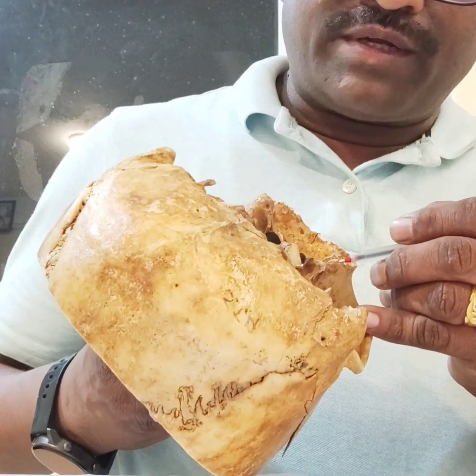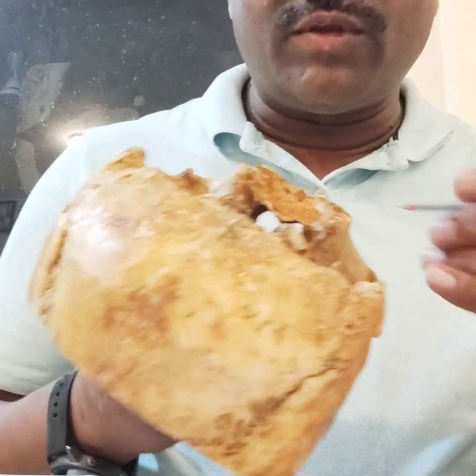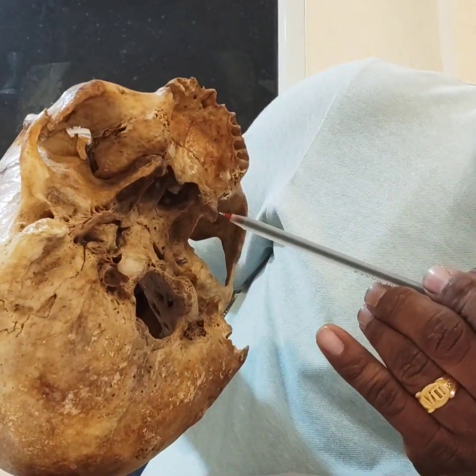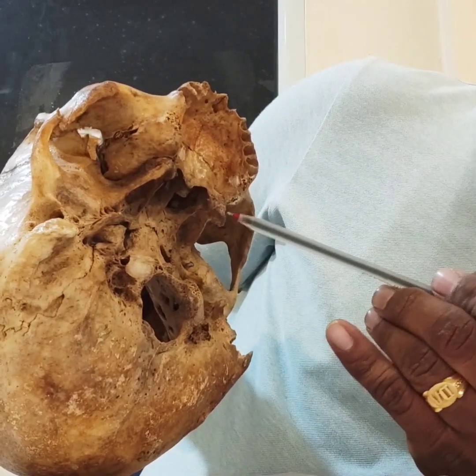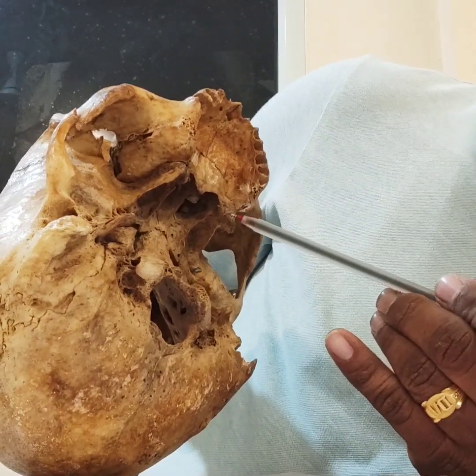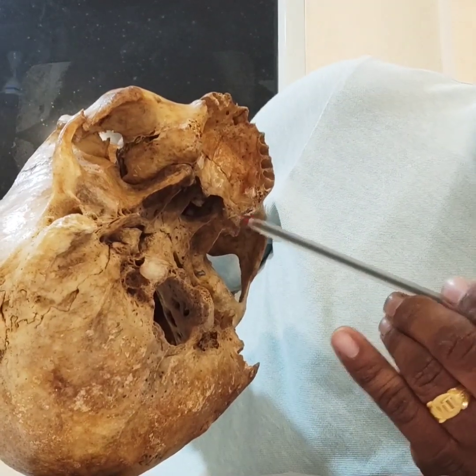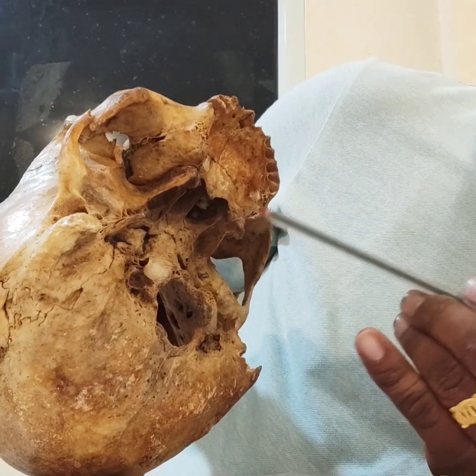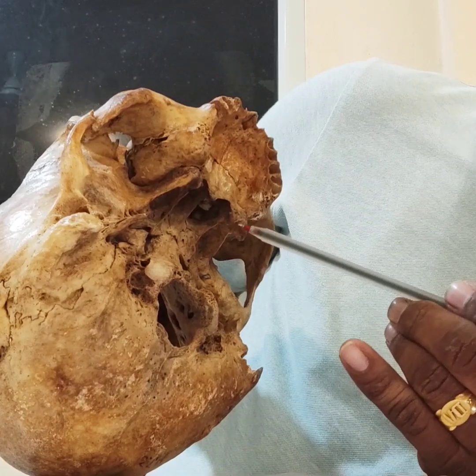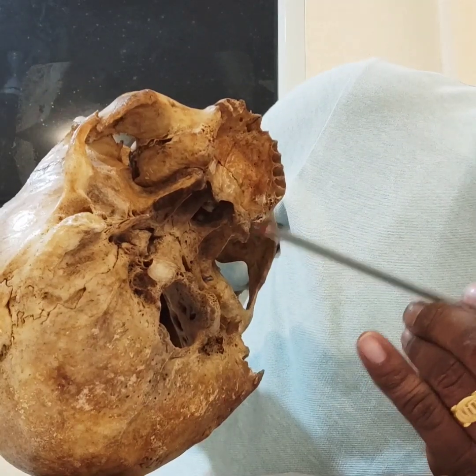In pterygoid implant placement it is a blind technique, because nobody perfectly knows where exactly the fusion zone is. The fusion zone is the area between the medial and lateral pterygoid where you are going to engage the implant. You have to locate this mineralized bone through a tactile approach — feel the bone with a pathfinder instrument, then proceed with the osteotomy and engage the implant in the fusion zone.